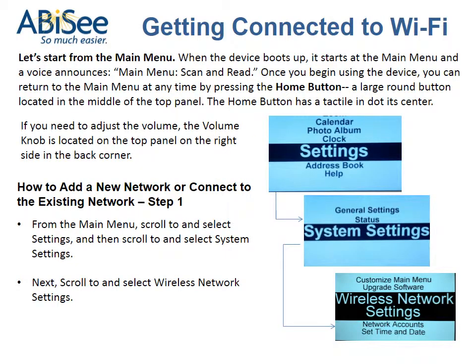Getting connected to Wi-Fi. Let's start from the main menu. When the device boots up, it starts at the main menu and a voice announces, "Main menu, scan, and read."